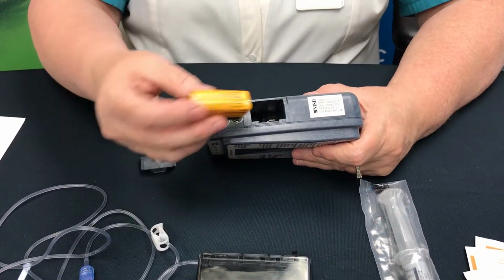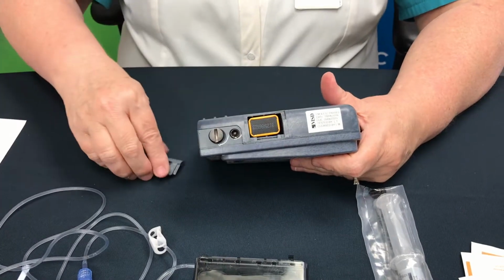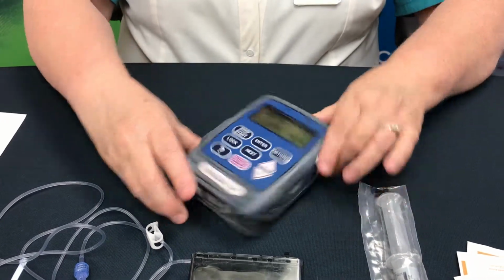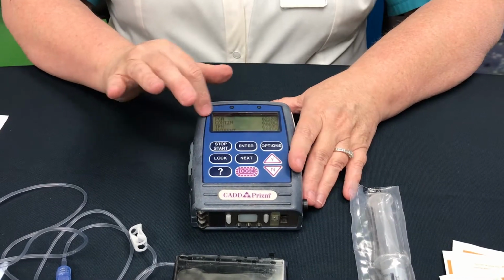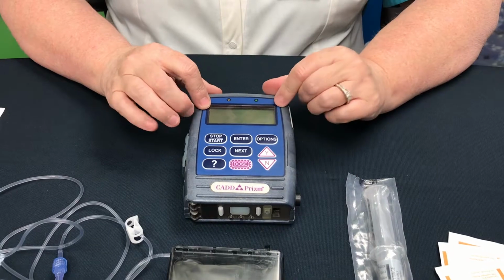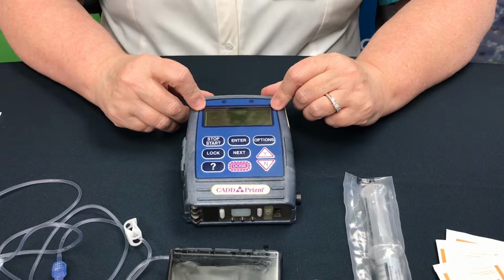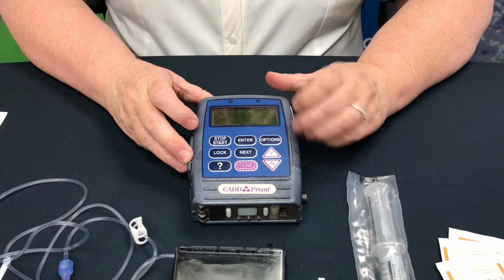The battery will only go in one way correctly. If I press it in and I hear a noise, then it is correct. I will slide the door down, and once I've done that, my pump will go through its initial setup process. It takes a few minutes to go through all the settings that have been put into the pump to make sure that it is ready for you. All of the settings will be specific to what has been ordered for you by your doctor.